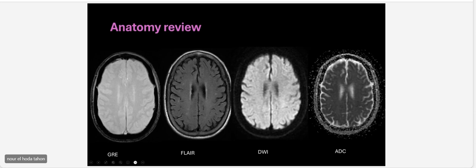If you see this in a patient maybe 60, 70 years old, you can say this is microvascular changes, like occlusion in the vessels. You can see this in the subcortical and periventricular white matter. It's very, very common in old age, like brain atrophy and prominent ventricles.